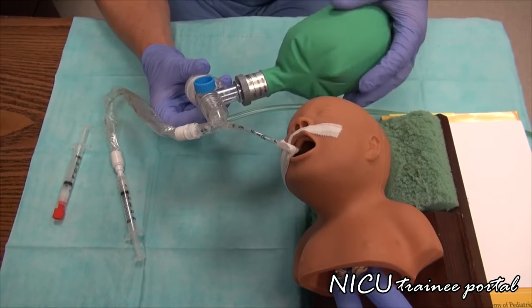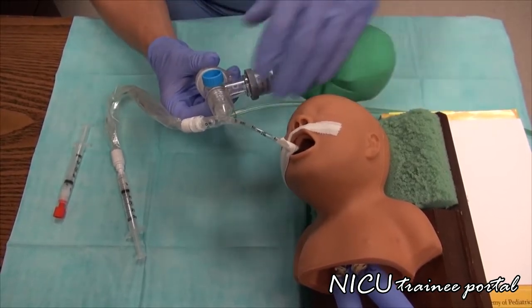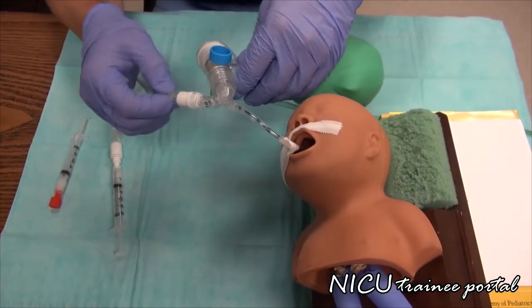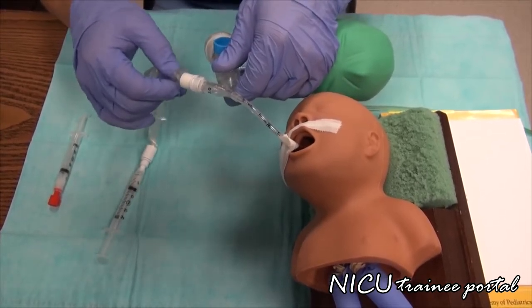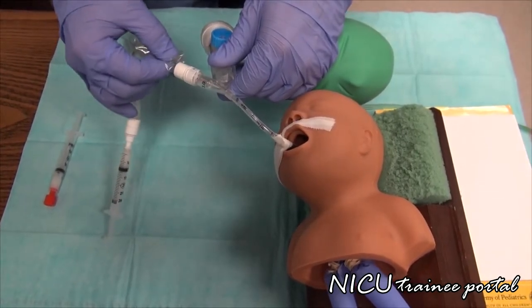And then after, we might bag at a little faster pace. So prior, here we're bagging at a normal rate, the baby is stable, we are listed to the right side, and we're ready to administer our first of the two aliquots. So here, I will begin advancing my catheter.